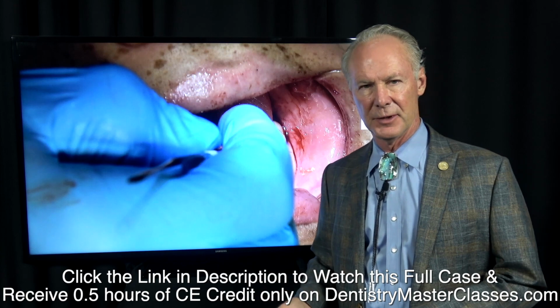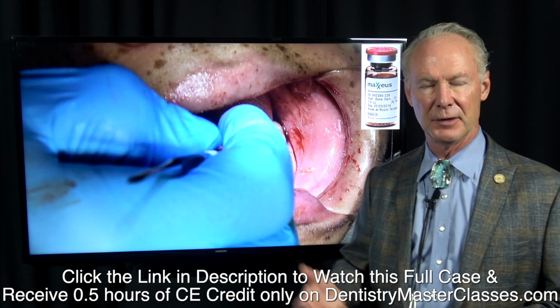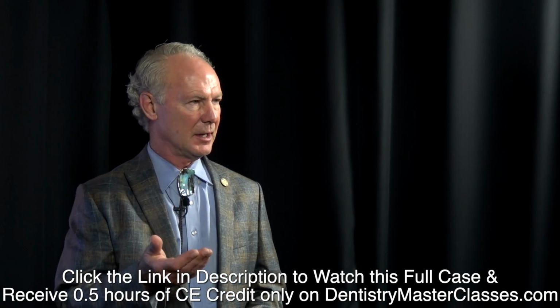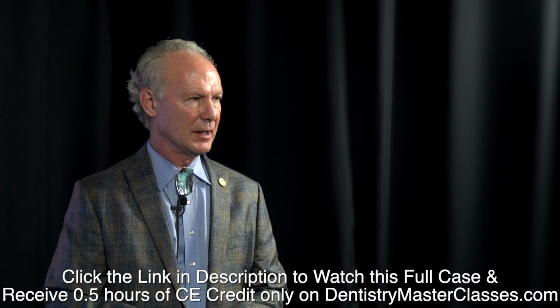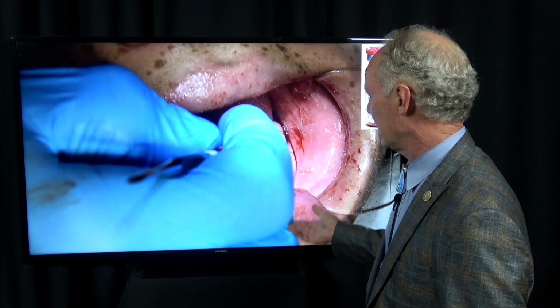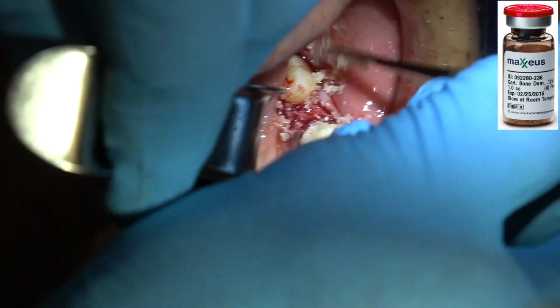I love platelet-rich fibrin. But to gain platelet-rich fibrin, the patient's got to have some veins in the antecubital fossa, because you've got to draw blood and spin it down. You really can't do that if they're just small veins, like hand veins. Some patients just don't have good veins, and it's very difficult to draw blood and then spin it down into platelet-rich fibrin. In this case, the patient didn't have very good veins. I used a hand vein for the IV sedation, but you can't draw blood from small veins.